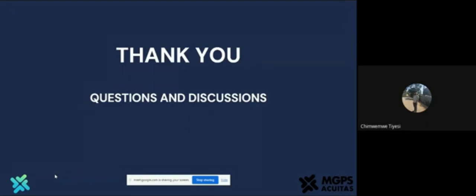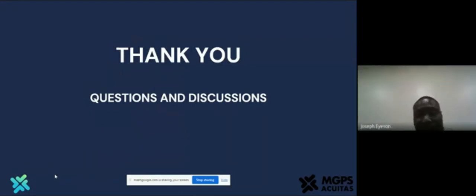Okay, thank you very much. I think this question is deep. When it comes to sizing of VIE tanks and the consumption rate, first you need to know your consumption rate at your facility, and then based on that you can determine what capacity is required.